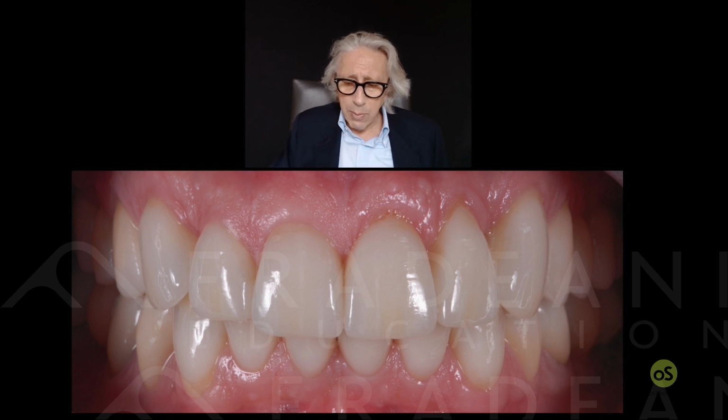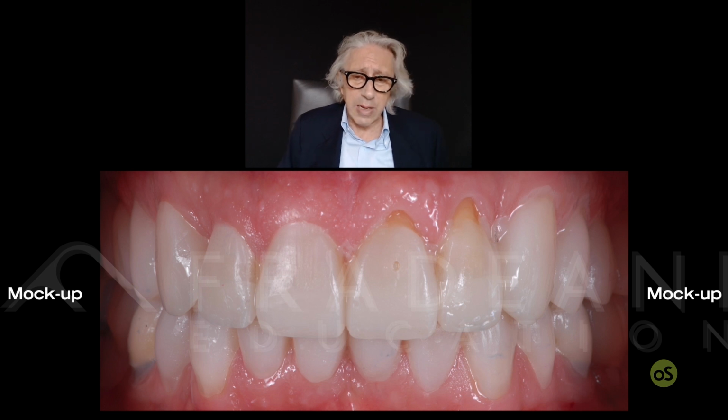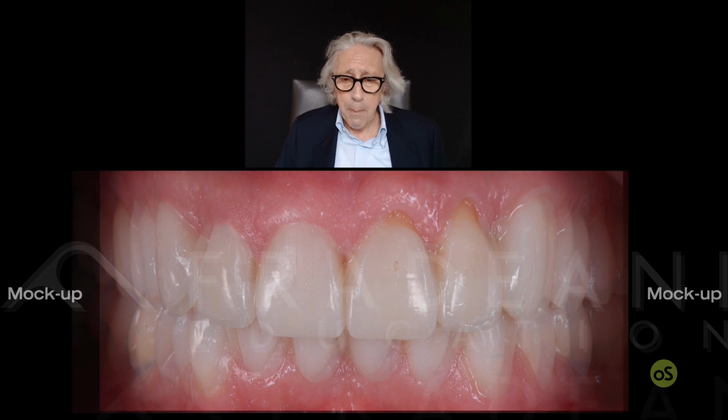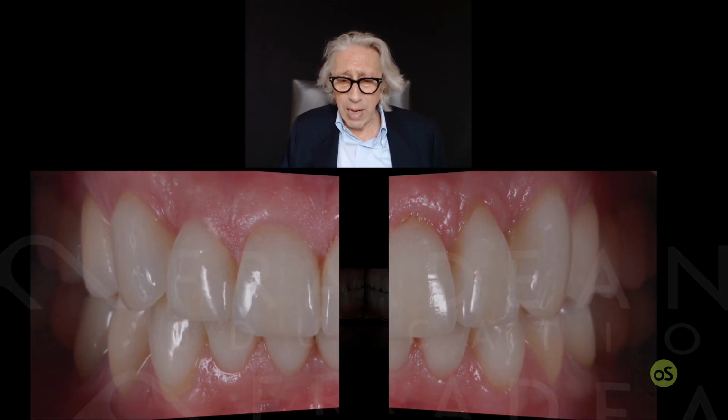So with the mock-up, we have already finished the work that in the real case you never started. You have not started yet, but you have finished already. You have not started to do any kind of grinding procedure on teeth. You have already finished your case, because if you have replicated your case to the final, it means that you are more than happy, and the patient too. It means that everything was working well. That is to say that we can really replicate something that you like.